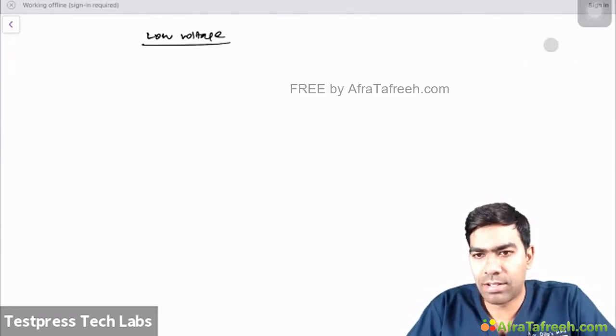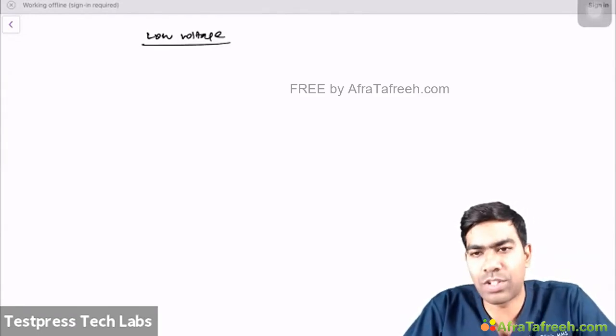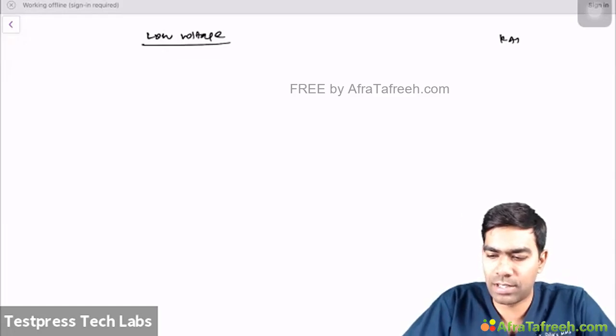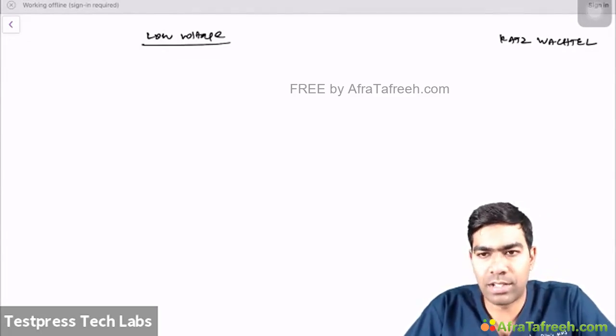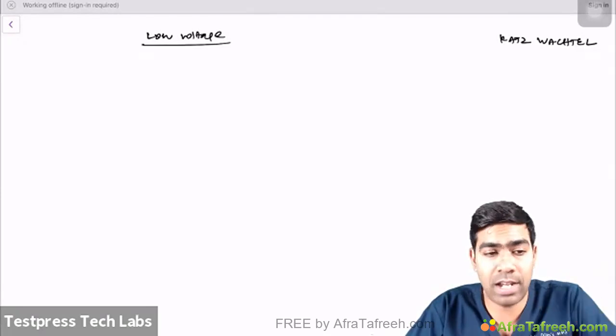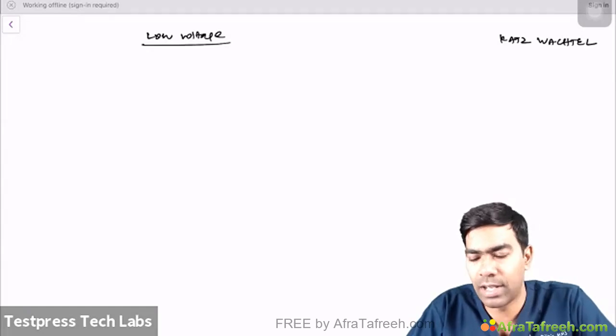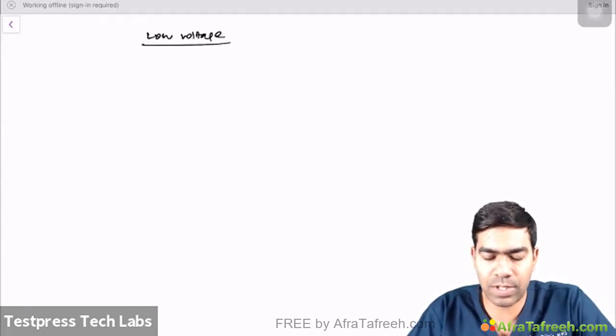Rijo already answered. It is the Katz-Wachtel phenomenon, or Katz-Wachtel effect. So that's one thing you have to know with regards to biventricular hypertrophy, which typically happens in the setting of a VSD: large biphasic complexes in the mid-precordial leads, that is V2, V3, and V4, which we refer to as the Katz-Wachtel effect or Katz-Wachtel phenomenon.